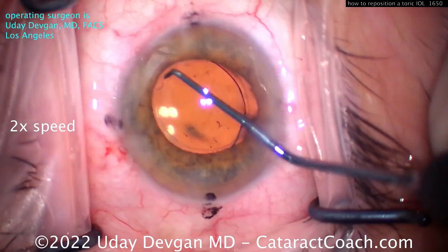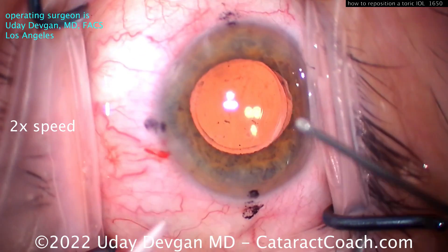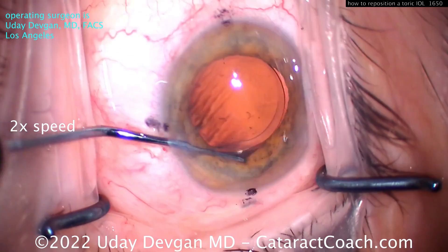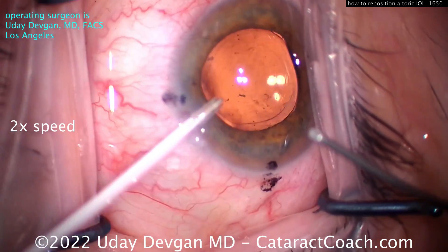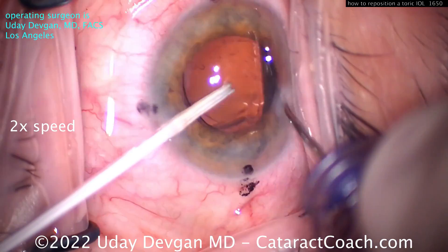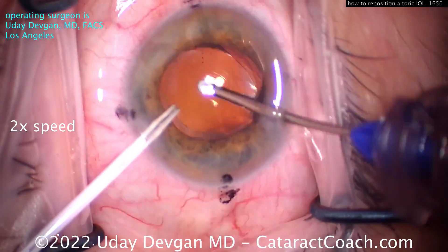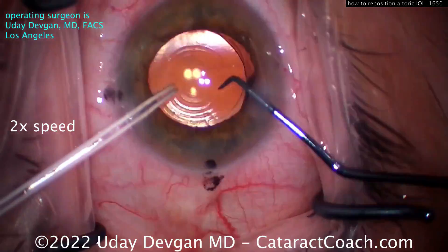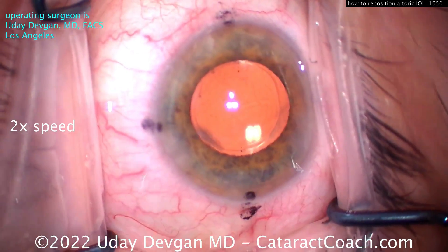Now we can get the lens re-rotated into the appropriate position — we're aiming for that 180 meridian. That looks pretty good. Once you get the lens lined up where you want it, you've got to remove the viscoelastic. We're not going to use coaxial because we don't have the main incision open; we're going to use a biaxial or bimanual approach. I'm using the Transformer IA suction device in one hand and a 25-gauge IV cannula in the other for infusion. Getting that viscoelastic out gently — even going behind the optic, because you don't want to leave viscoelastic back there as that's going to allow the lens to slide around. This lens should adhere back down to the capsular bag, though you won't have as much of the shrink-wrap effect at this point.